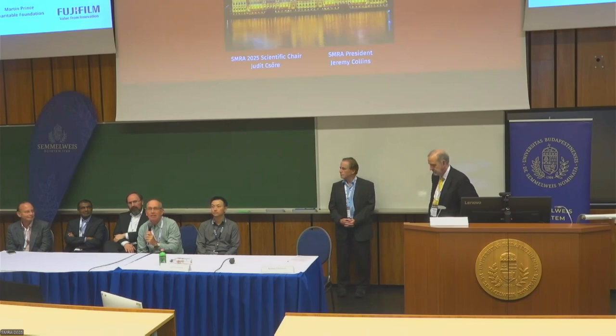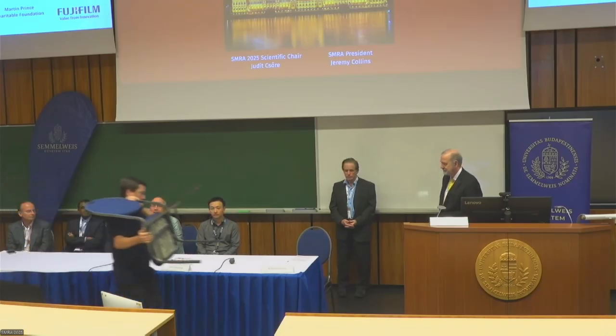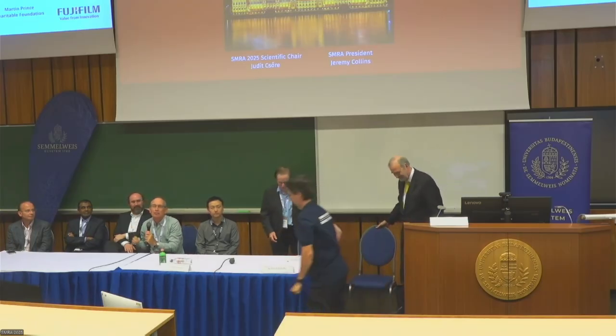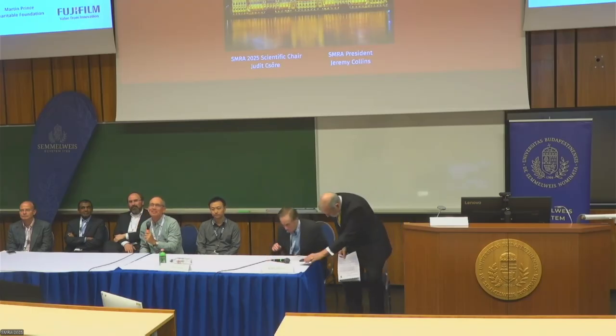Obviously, in the presence of devices, wideband and the like, maybe multi-contrast will help us. It'll be nice to see that edema as well as the native T1, because then it'll tell you why you're getting non-inducibility. So I think there's lots of room for improvement on the technical side, but obviously what we're trying to show right now is clinical efficacy. But yeah, no, keep driving on the technical. We need it.